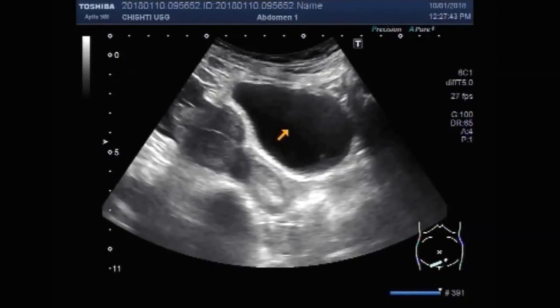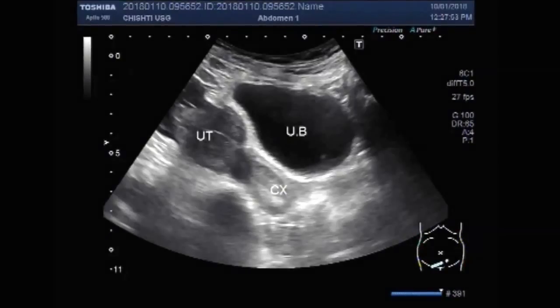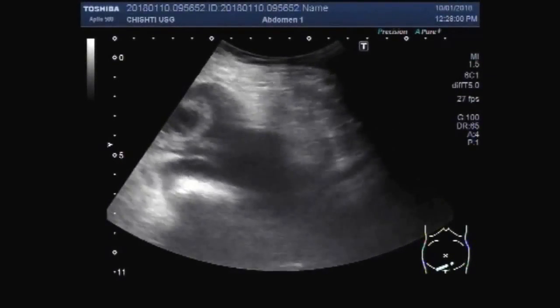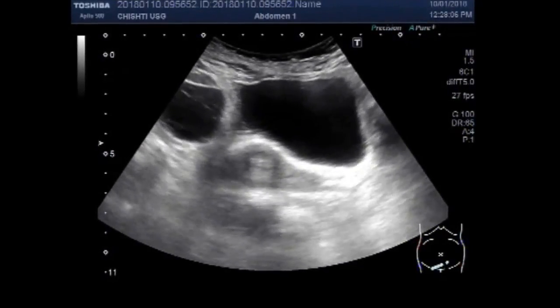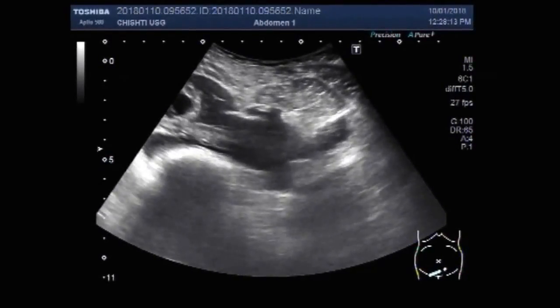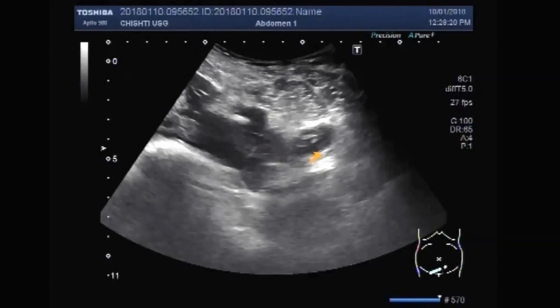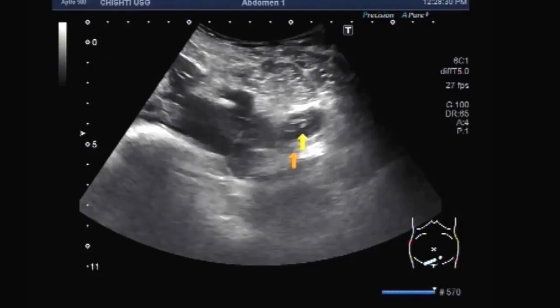This is the urinary bladder, and this is the uterus and cervix. Now you are going to see both ovaries. This one is the right ovary.